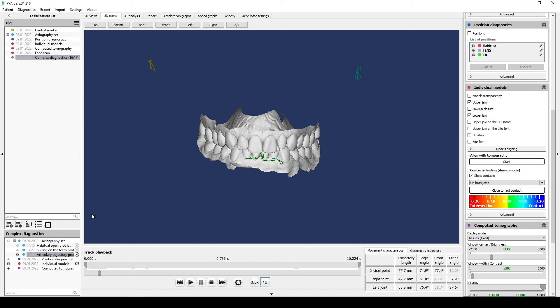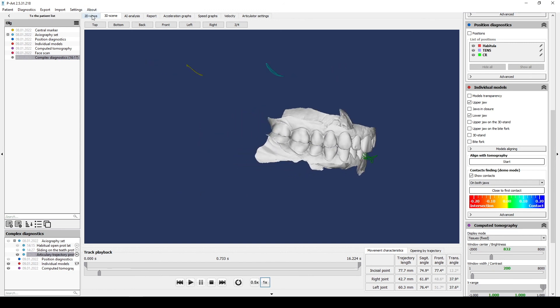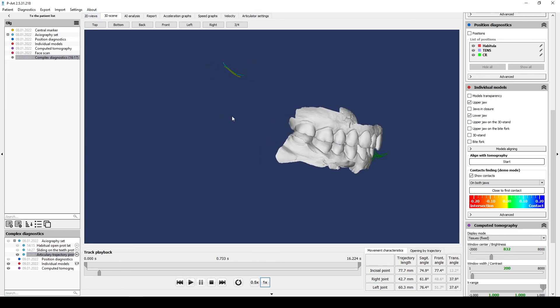All trajectories recorded together to evaluate how trajectories of opening, protrusion and lateral protrusion are similar in the initial stage or have some differences. It's all necessary for functional analysis.